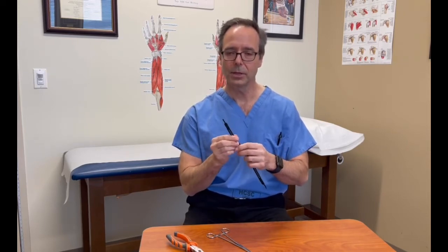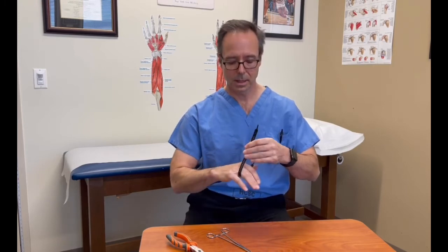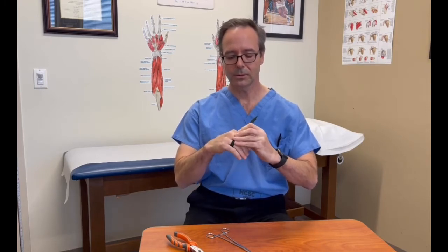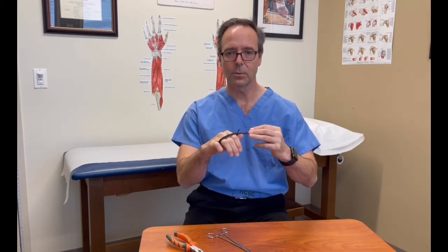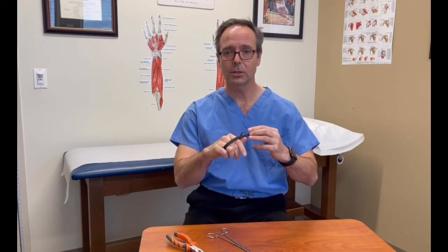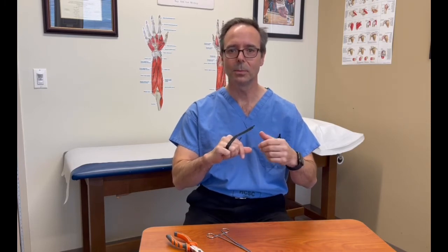So you'll have the patient, and we're going to demonstrate a middle finger yoked into extension first. The band is applied directly to the hand, and this is basically the sizing step. So you size the band and you find the perforation that you think will fit best. I will say that if you're between sizes, always choose the larger size. The band loses a little diameter through the locking process and through the bending of the splint. You'll lose a few millimeters, so save yourself a step and choose one size bigger.